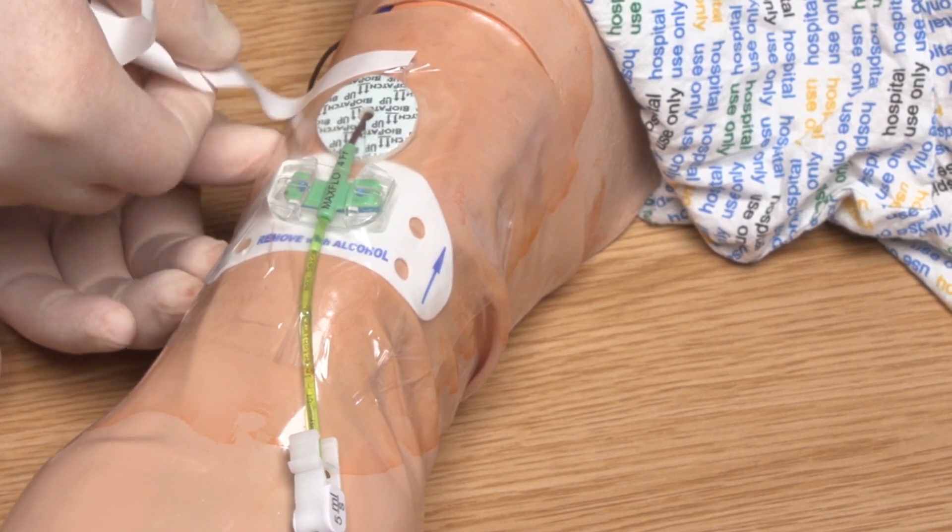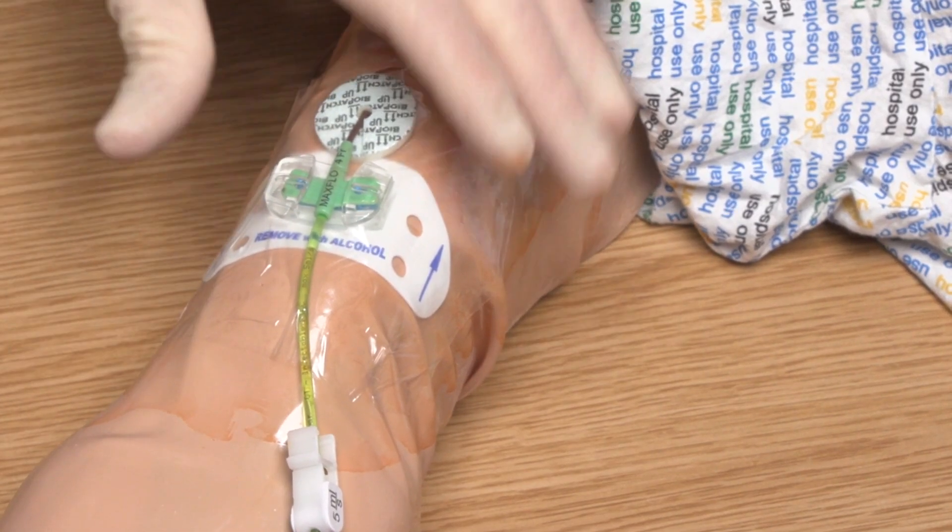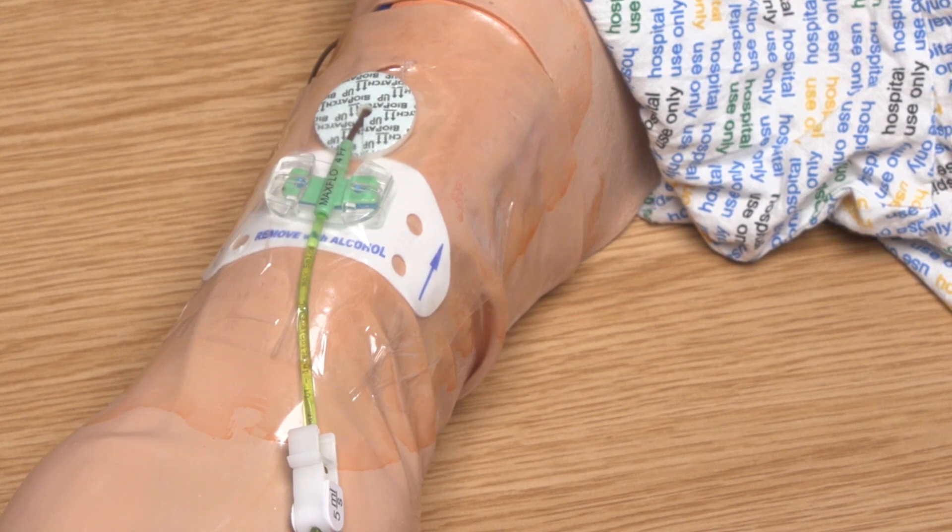Finally, I am going to apply the semi-permeable transparent dressing on top of the securing device and biopatch dressing. Following completion of the procedure, I can dispose of all used equipment into the clinical waste, remove my PPE and perform hand hygiene. Redressing of the vascular access device should be documented in the associated care plan.